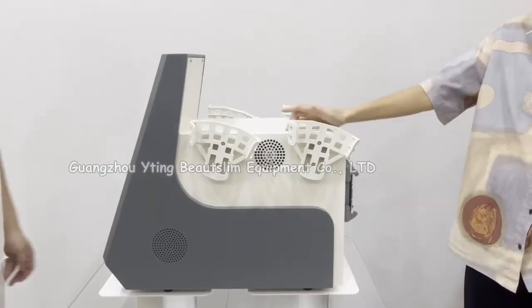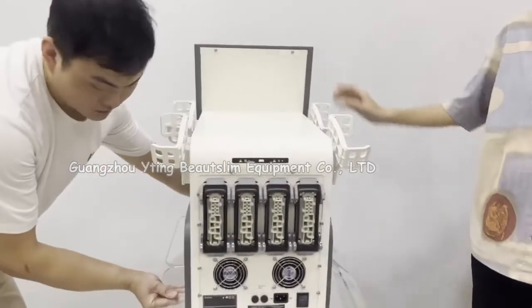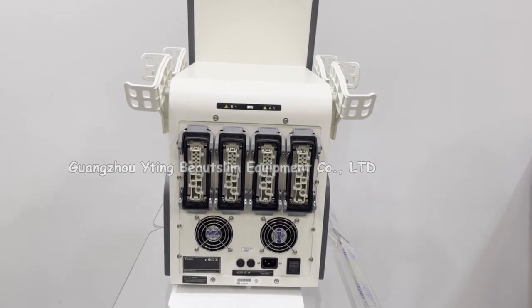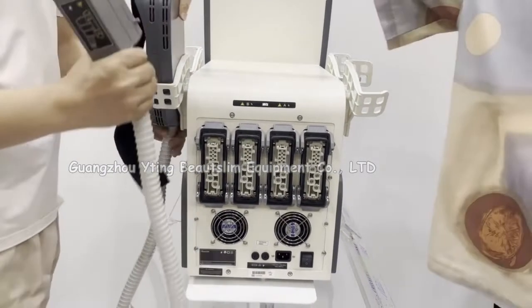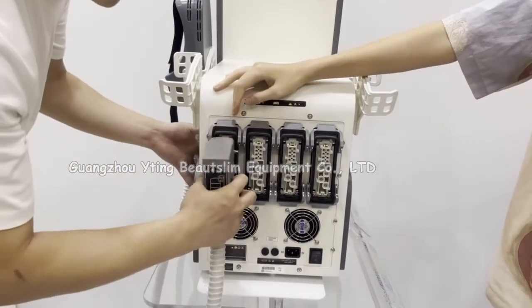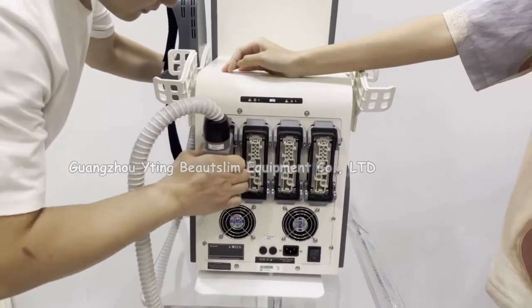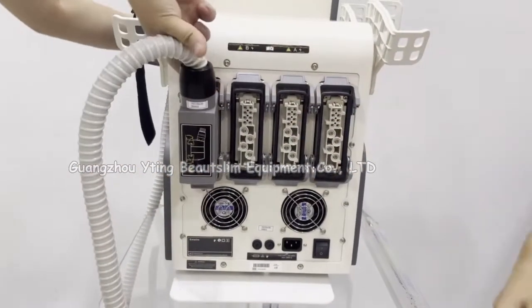Install the other two holders in the same way. Now connect the handles. Connect one small handle here. Lock the handle by these two parts.